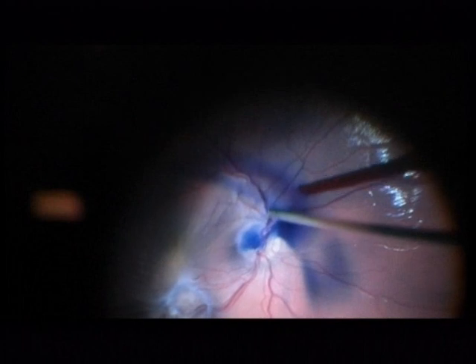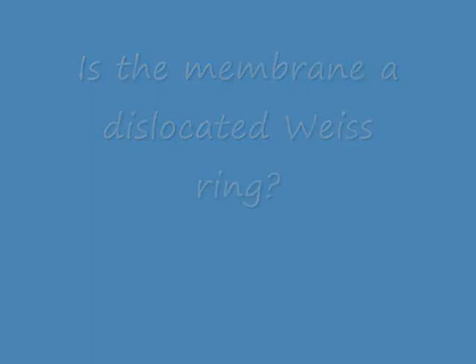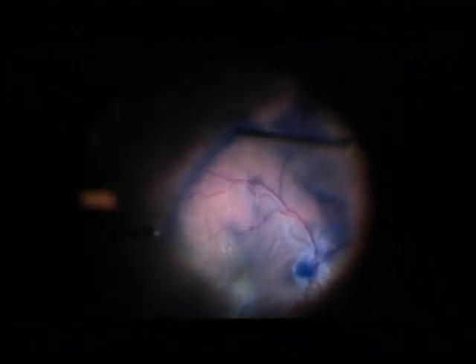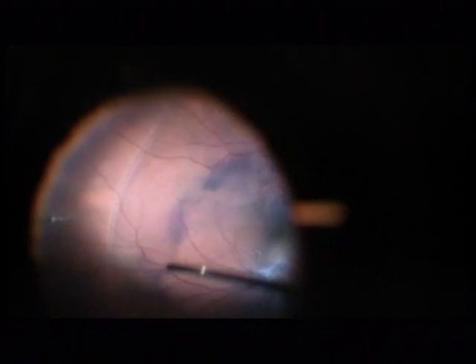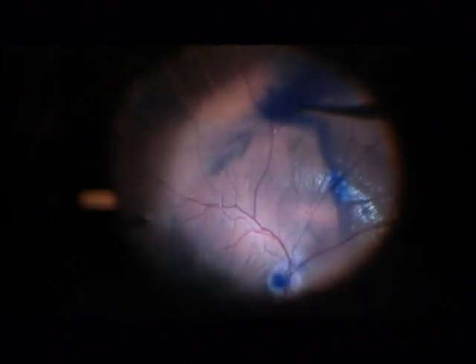Now I have the PVD, which is difficult in young people. Here is an interesting question: is this a dislocated Weiss ring? I don't know.